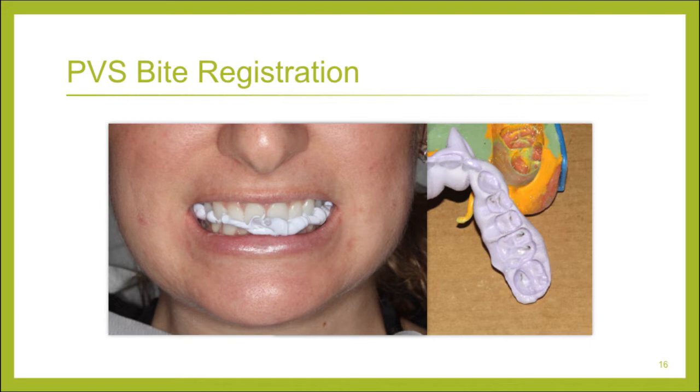And I'll tell you, seeing is believing. I wanted to be proven right, but I can tell you that he was right. The patient was able to bite right into this and really get a good bite. And let me show you this, because what makes a good bite is when we can take it out of the mouth once it's set and hold it up to the light, and you want to see these little areas where the patient has bitten through it. If it's solid all the way around, you did not get a good bite, and it tells you the patient did not bite down all the way.